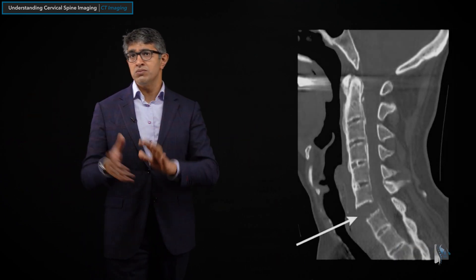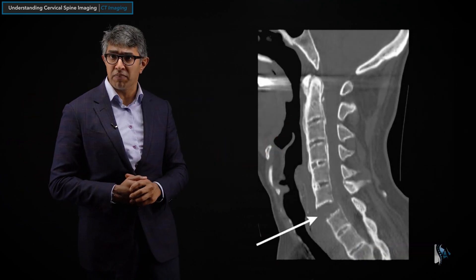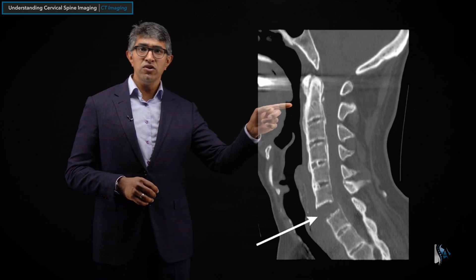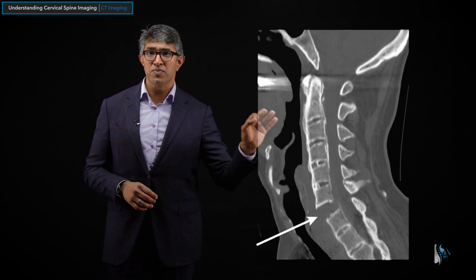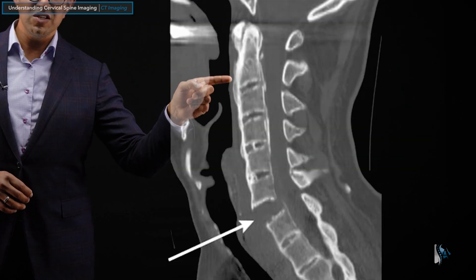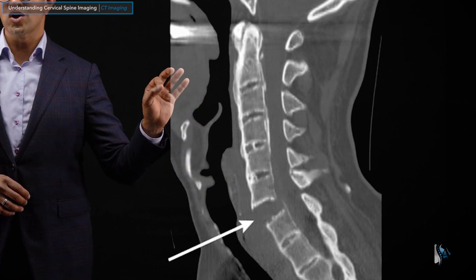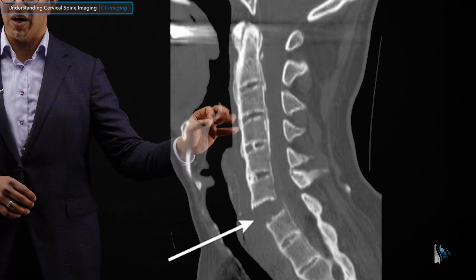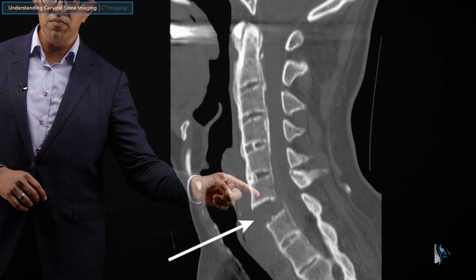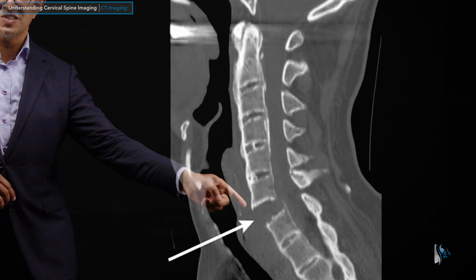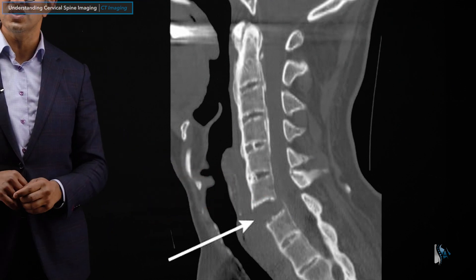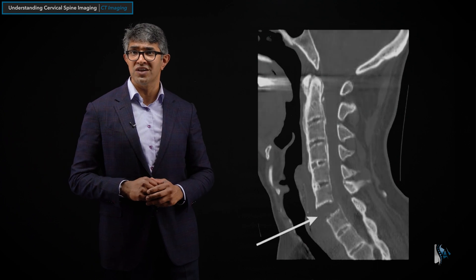This is most of the time how your surgeon will look at these images. Now, if you were to look at abnormal studies — those were all normal images — here are some examples of abnormal pathology. Here's a sequence in somebody with ankylosing spondylitis. You can see these bones have all fused together; people have what they call colloquially bamboo spine. It's very brittle, and somebody has a fracture right there — you can see that discontinuity is not normal. That big arrow is pointing right to it.